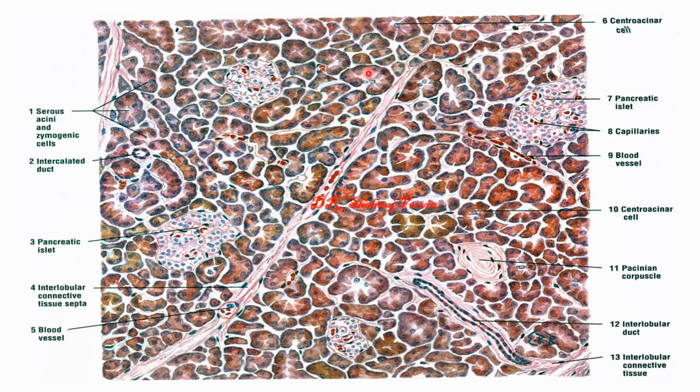Now exocrine acini has pyramidal cells contain the pancreatic enzymes, and these endocrine gland contain the alpha cell, beta cell, pancreatic polypeptide secreting cell, PP cell, delta cell. Alpha cell secrete glucagon, beta cell secrete insulin. So very simple to write this histological structure.